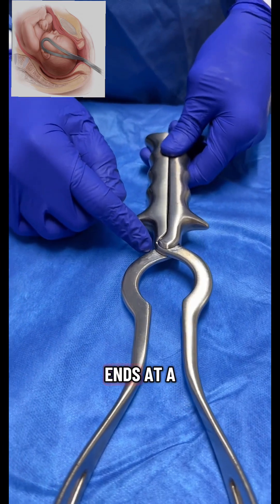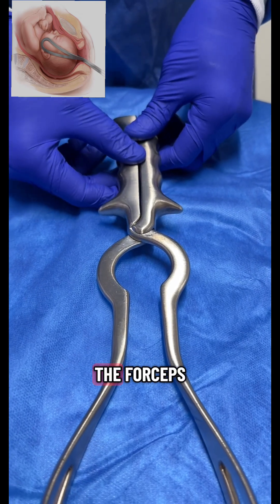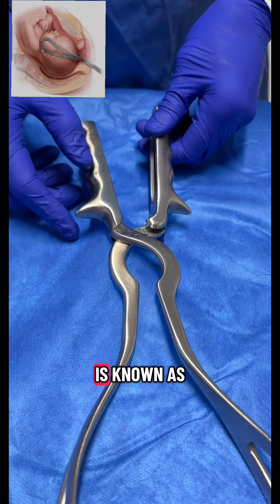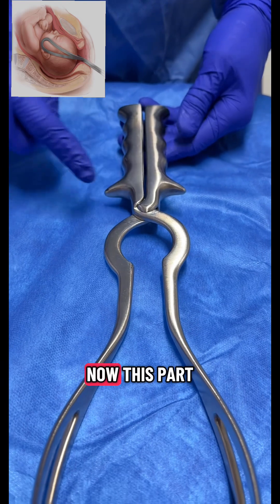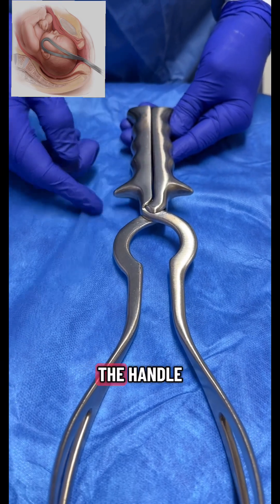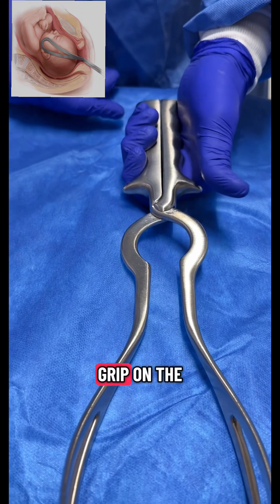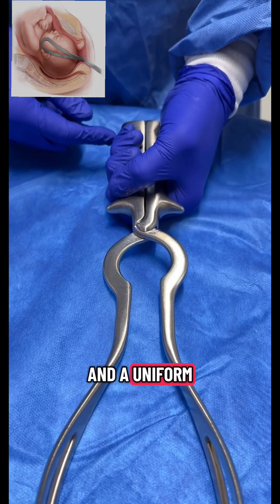The shank ends at a junction known as the lock of the forceps. This is a fixed lock known as an English lock — it goes in and remains fixed. The next part is the handle, which has grooves for a good grip so that it does not slip and a uniform traction is applied on the baby's head.